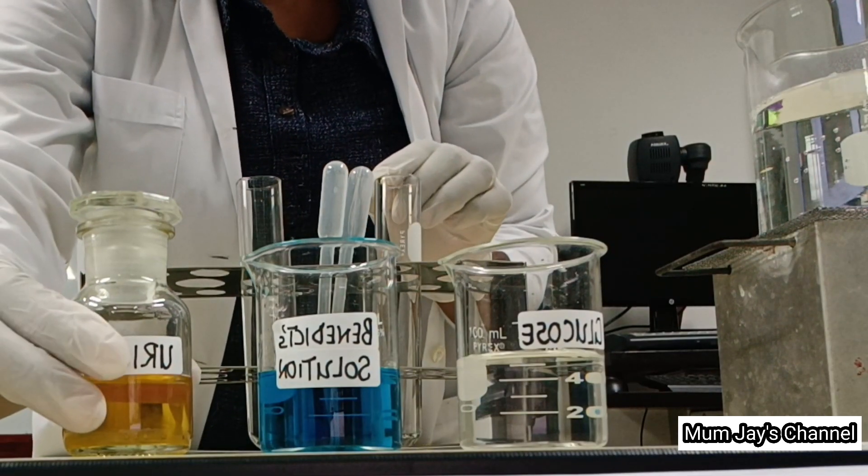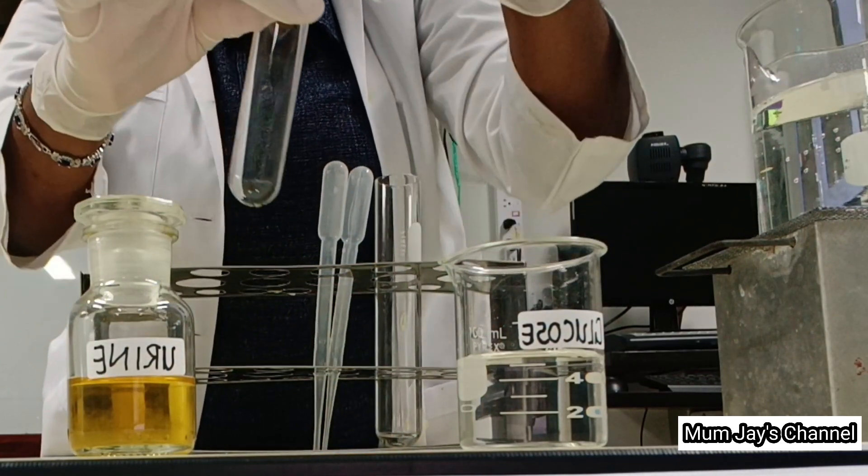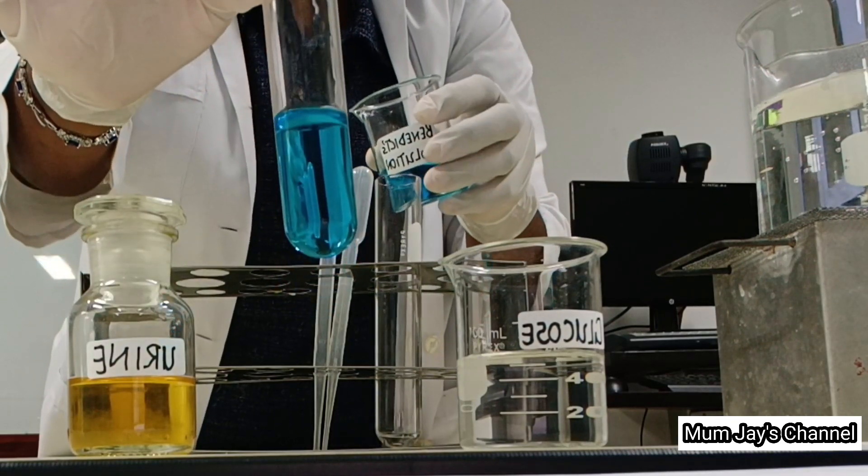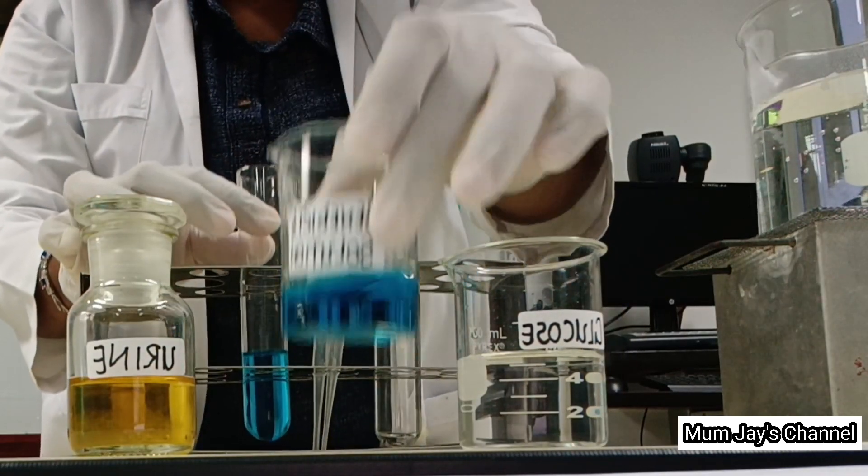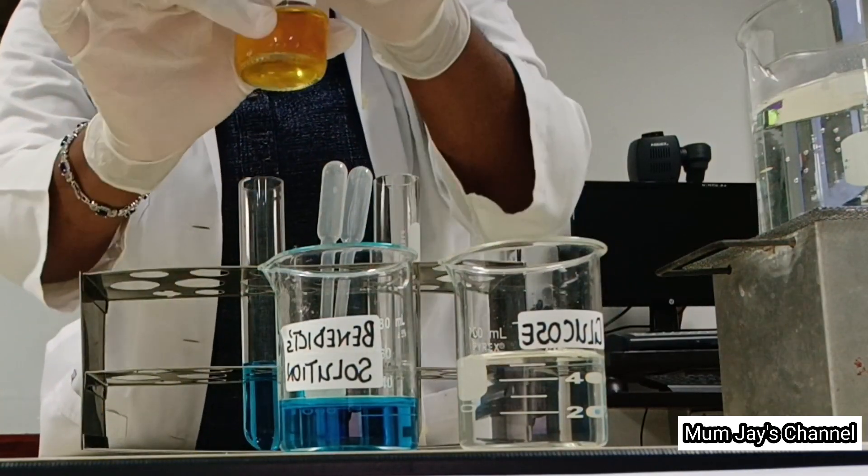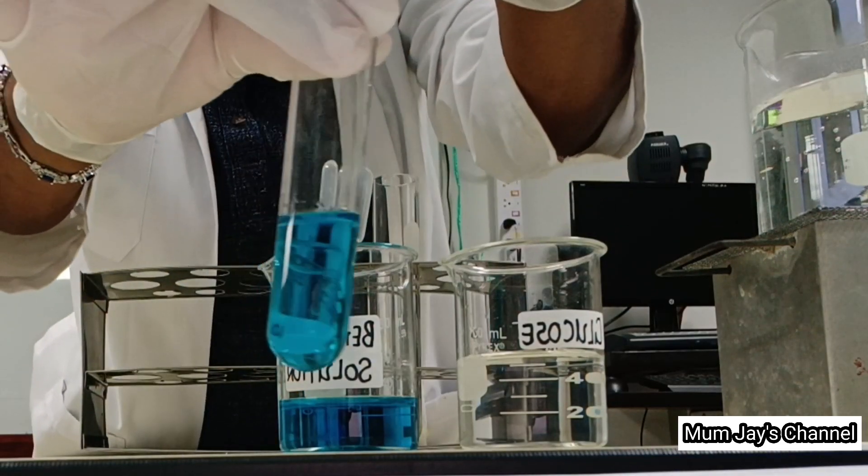First we will measure out two milliliters of our Benedict's solution and put it in the boiling tube, and then we add one milliliter of our freshly obtained urine.